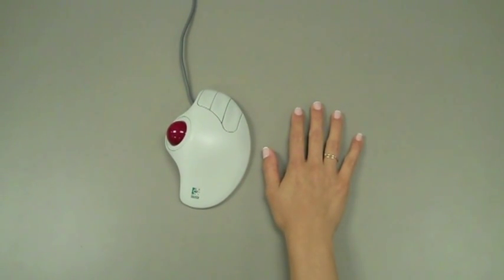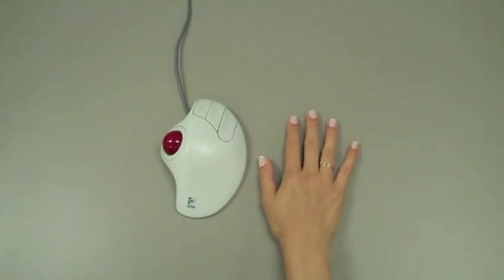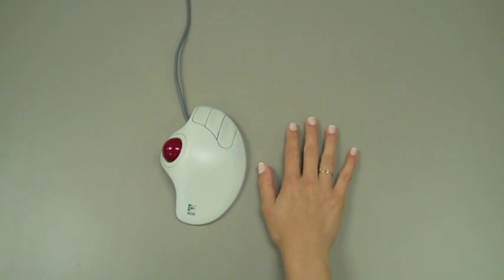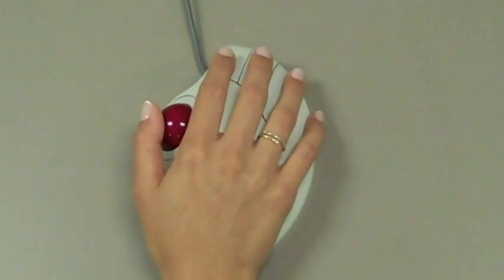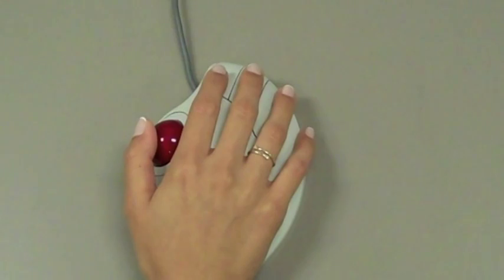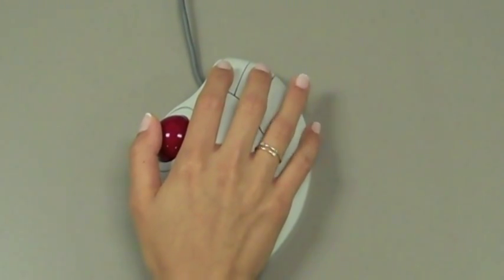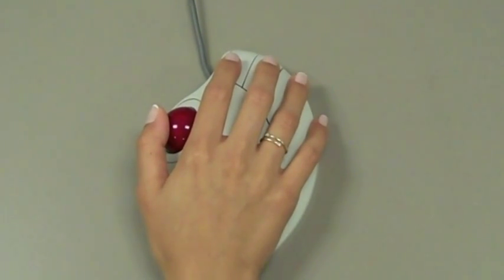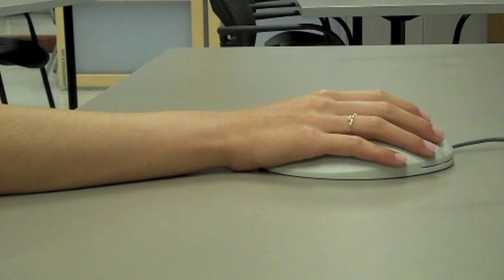This is a thumb trackball mouse. The participant's hand is in a neutral position next to the mouse. Now, let's have her put her right hand on the mouse. As you can see, her thumb is on the trackball. Her second digit is placed on the far left button. Her third digit is placed on the middle button. Her fourth digit is placed on the right button. And her fifth digit is placed on the right side of the mouse. Looking at the side view, notice that her wrist is extended in this position.